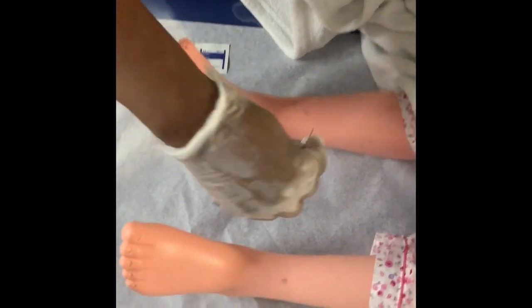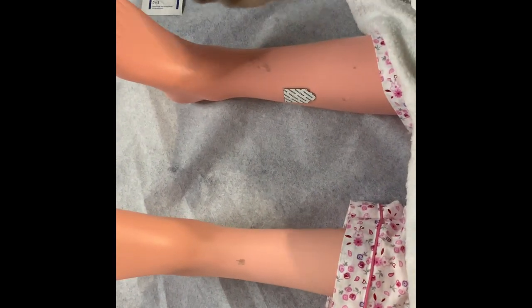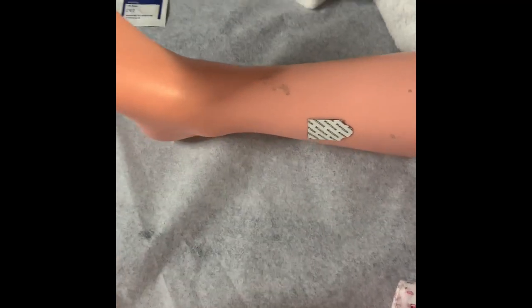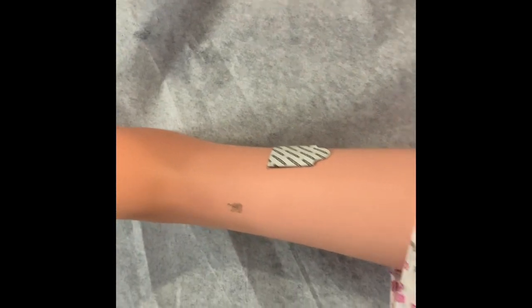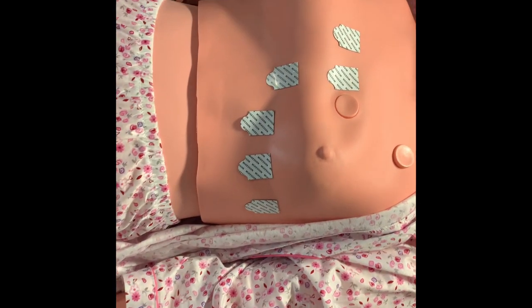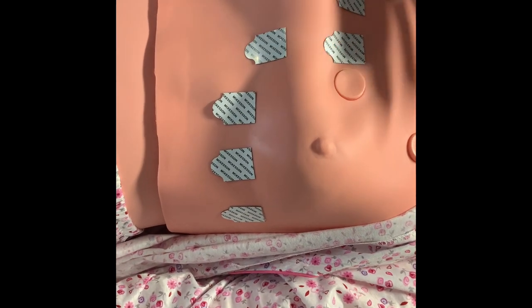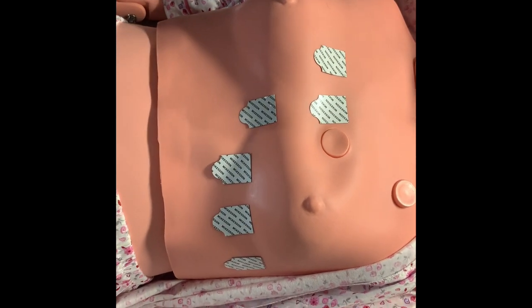I'm going to go ahead and place electrodes on the patient's legs — one goes here and one goes here. As you can see, they're on the patient's legs. When you have the electrodes on the upper, superior part of the body — the arms and the torso — you want to make sure that your electrodes are facing towards the ground.